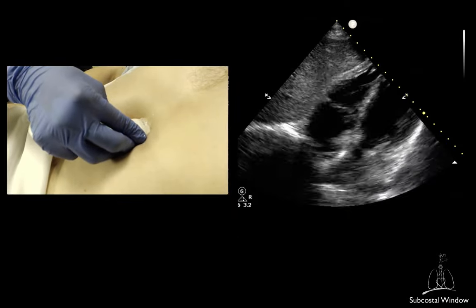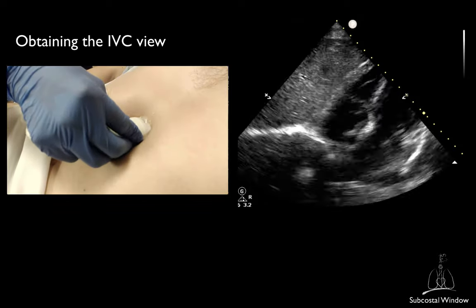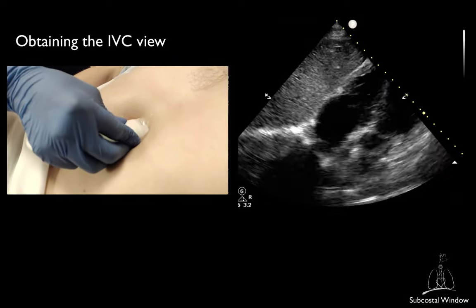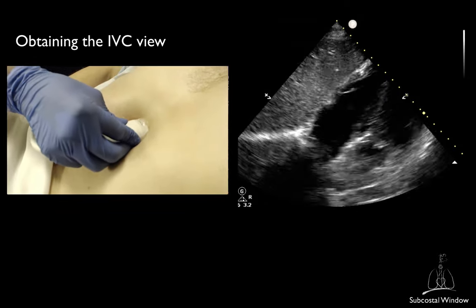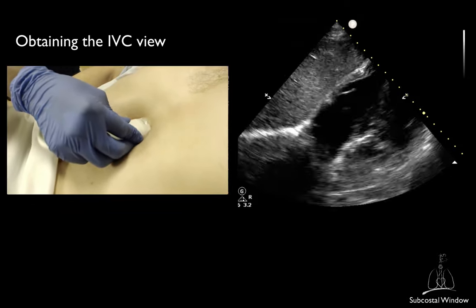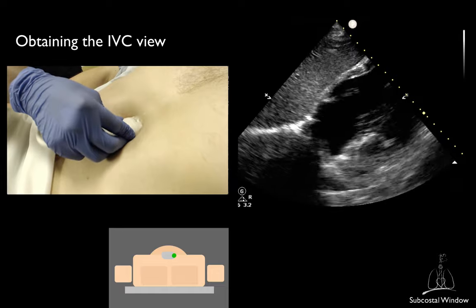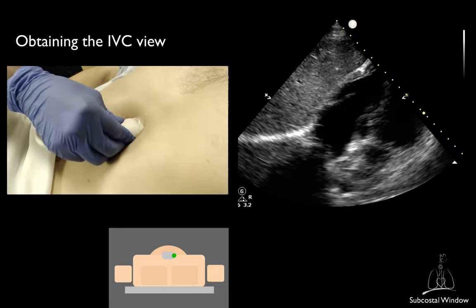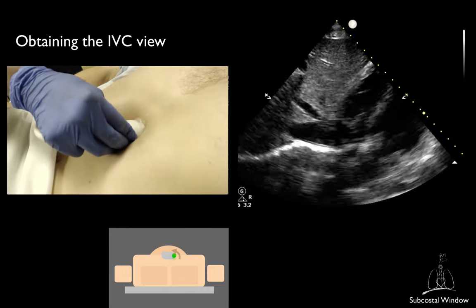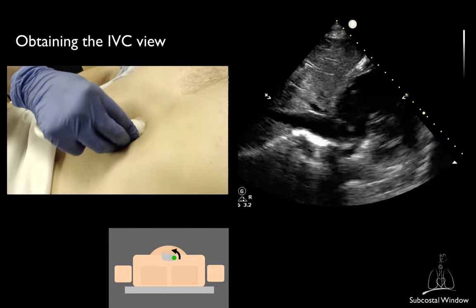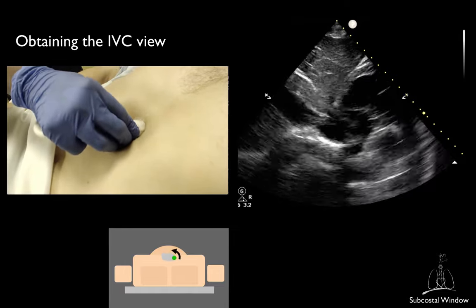To obtain the inferior vena cava from the subcostal 4-chamber view, first bring the right atrium to the middle, then rotate counterclockwise, keeping the right atrium in the center.